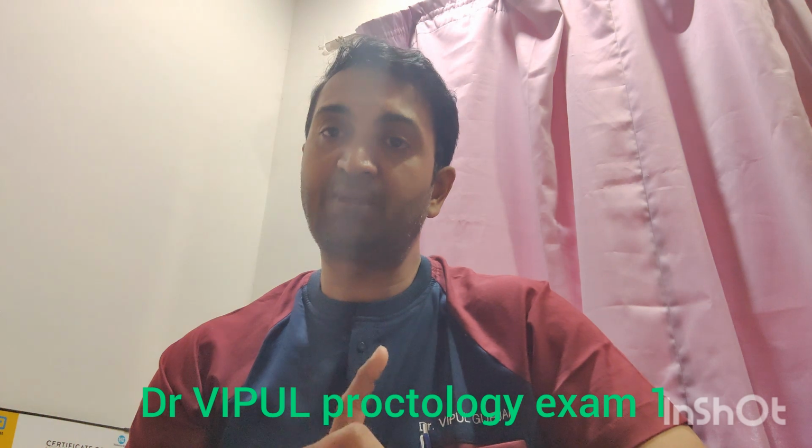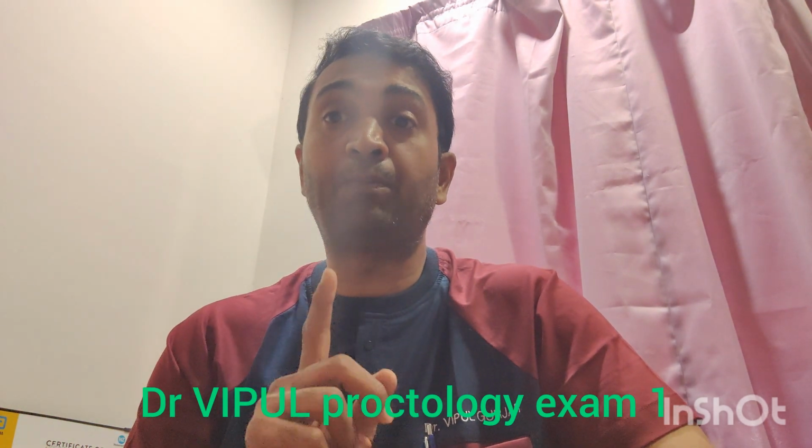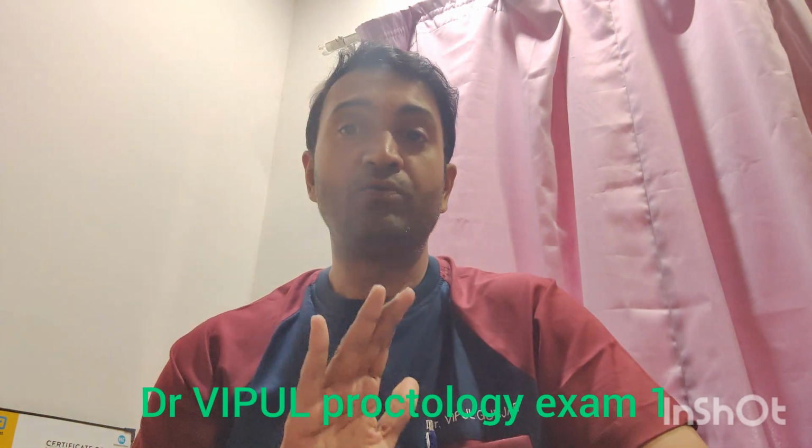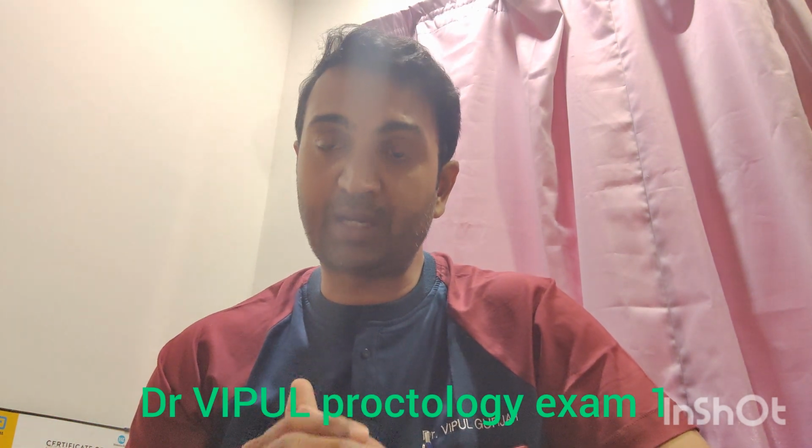In a semi-hip flexed position, you can do the per rectal digital examination. But we need per rectal digital examination, visual examination of the perineum, as well as proctoscopy examination. That's why I suggest you do the examination in the flexed knee, flexed hip, bending forward position.